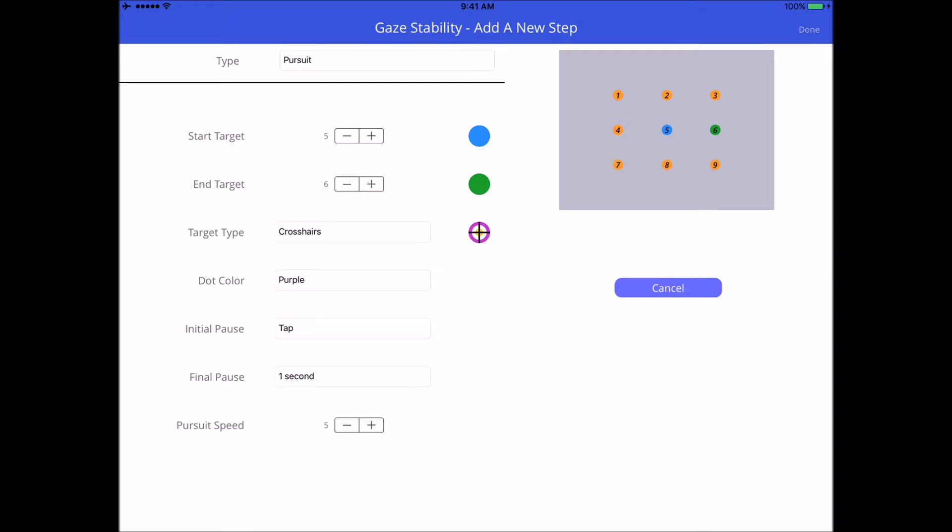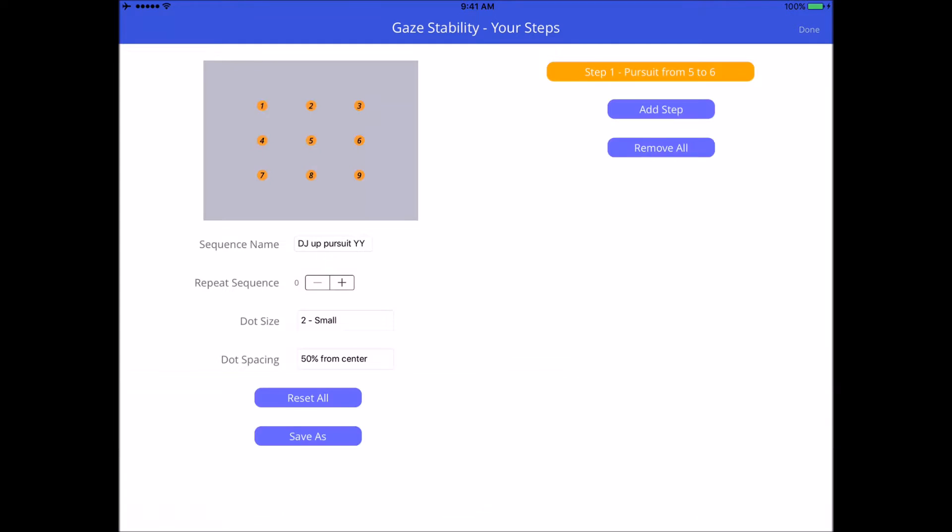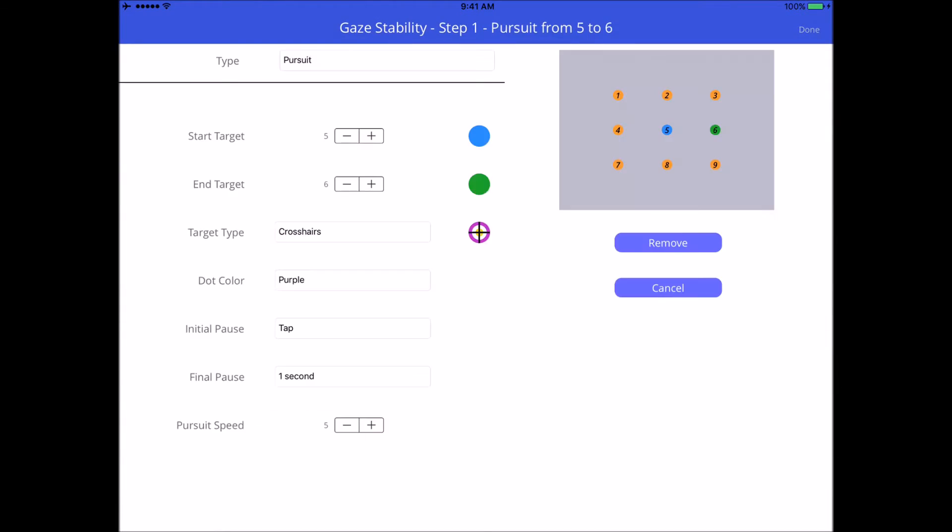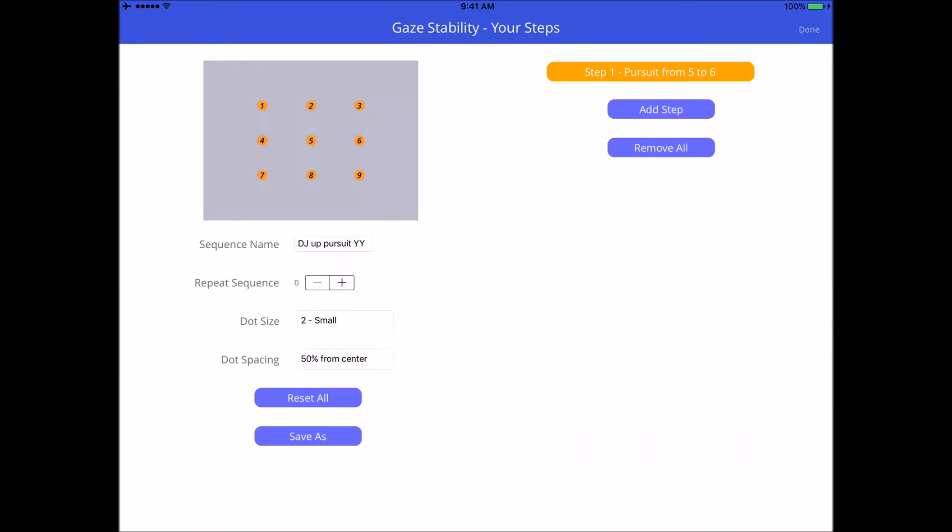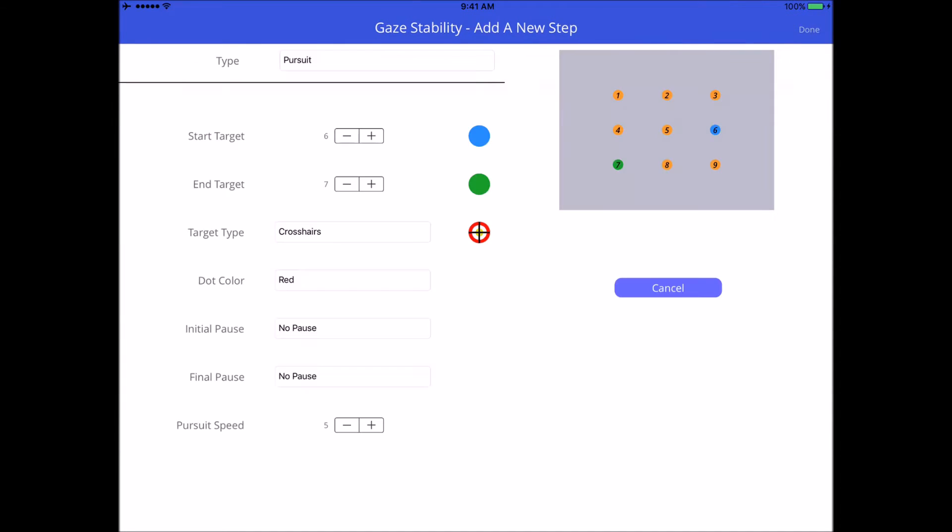Let's keep the pursuit speed at five, and then I'm going to hit done. That's automatically saved up here, and if I want to make any modifications to it I can just click on that orange bar and change anything I want. Let's keep it the same. Now I'm going to add another step. This time I can go to really any of the other targets on the screen, but I'm going to go from that right one back to center, so I'm going to go back to number five.